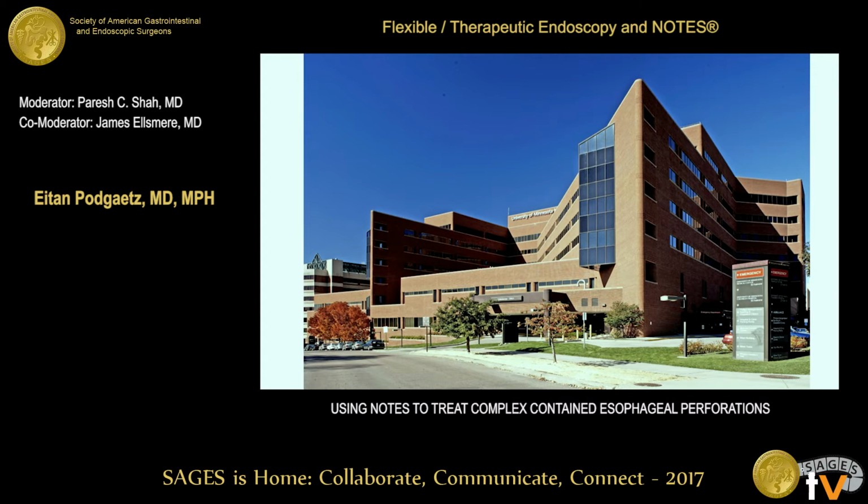I haven't used the double J stents, but I think it's 2 points. One, it's I think what's happening in trauma. Now they have the irrigation vac, so we're using that a lot more. So it's the same concept. And two, I think the key part is achieving good drainage, right? I think the type, color, and shape of the tube is secondary. I think the key is you have good drainage of the cavity, you establish good nutrition for the patient, and that's how you're going to allow it to heal. I think we're all trying to learn which one is the best tube and which one we can avoid the most interventions for patient and make it the most comfortable.